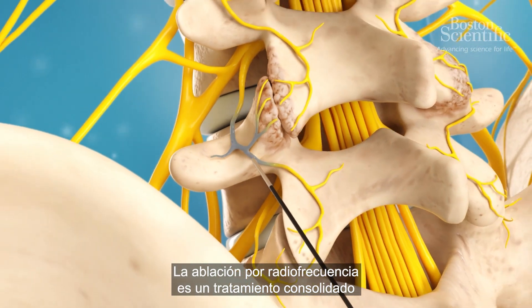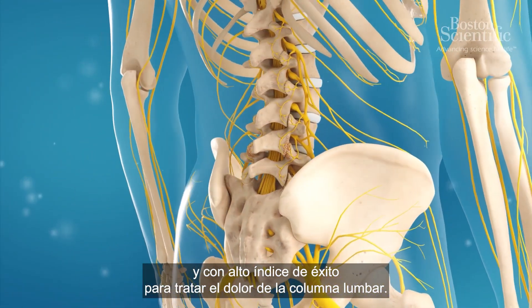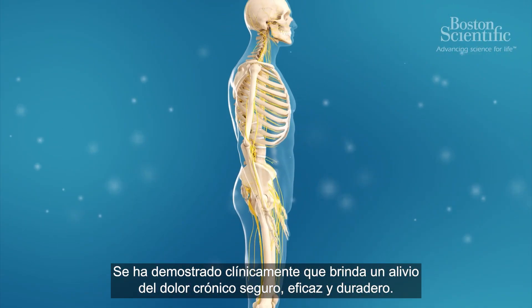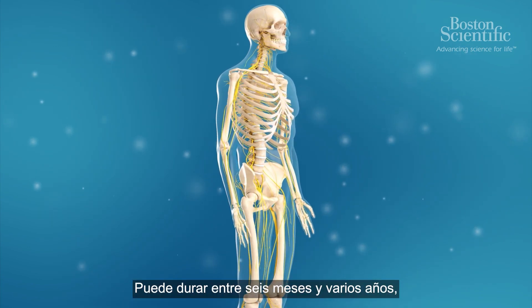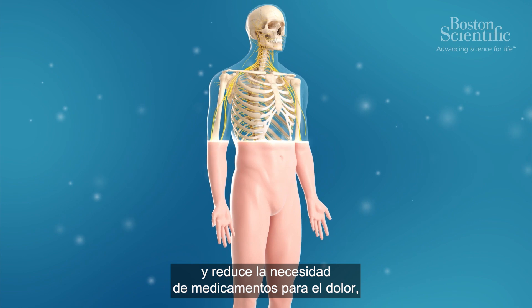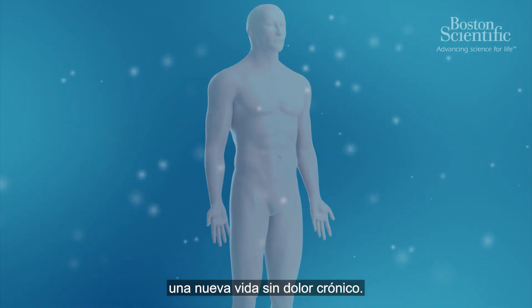Radiofrequency ablation is a well-tested and extremely successful treatment for lumbar spine pain, clinically proven to provide safe, effective, lasting relief from chronic pain. It can last between six months and several years and reduce the need for pain medication, giving patients the chance to start their new life without chronic pain.